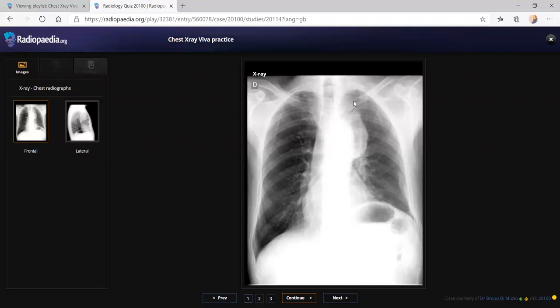It is in the anterior mediastinum, because there won't be any lung outline in the anterior mediastinum, because you know the structure of the anterior mediastinum. Yes. So you can see the cardiac knuckle and aortic knuckle here very clearly, and the hilar vessels are also seen. So this is an anterior mediastinal lesion.